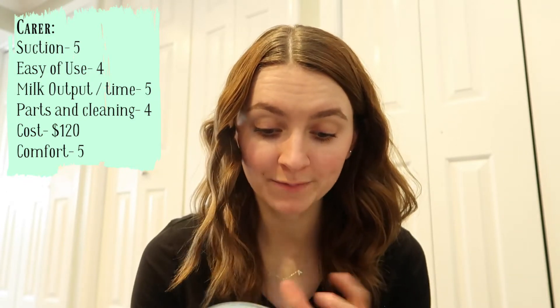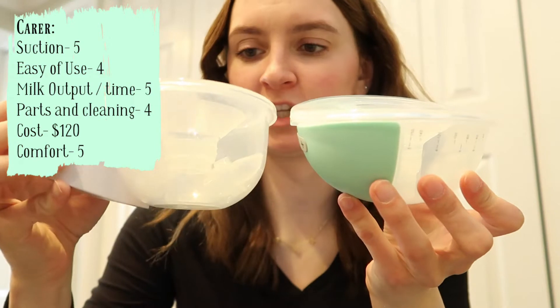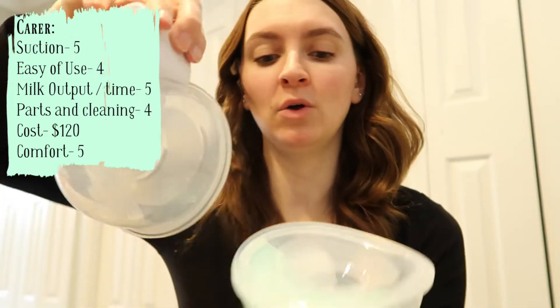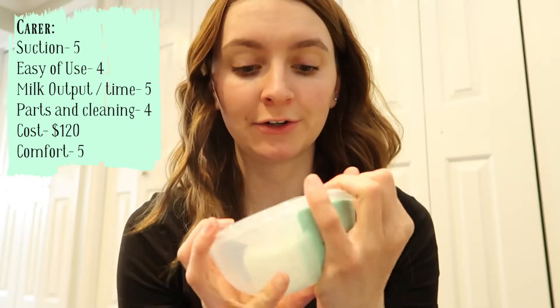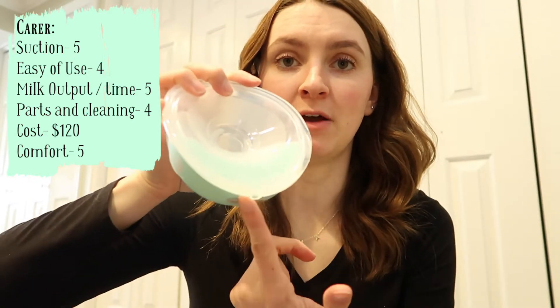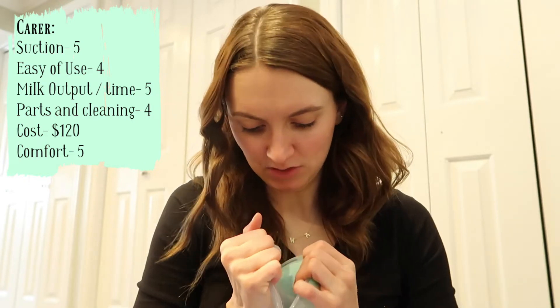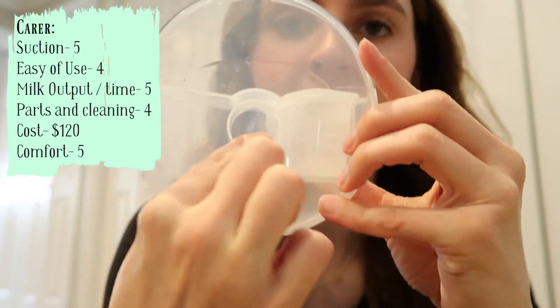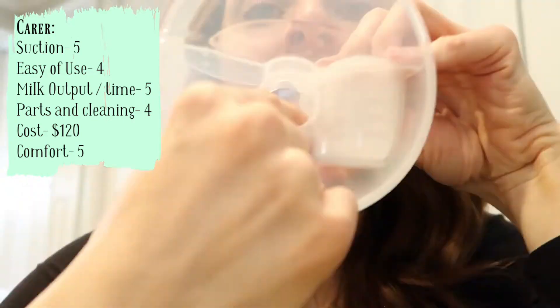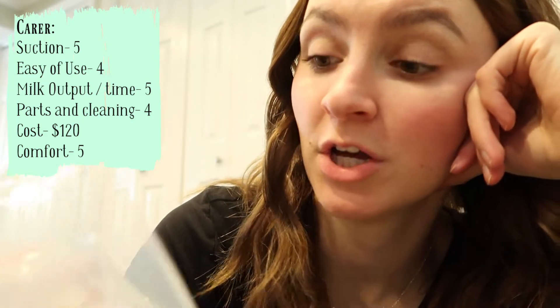For parts and cleaning I give it a four — super easy. The base is bigger than it looks and holds more milk. To empty it, you literally just pour it out of the spout — you don't have to pull anything apart. My one issue is that milk sits in the bladder awkwardly; sometimes when you remove the pump it can spill and you lose your milk, so you have to be careful taking it off.